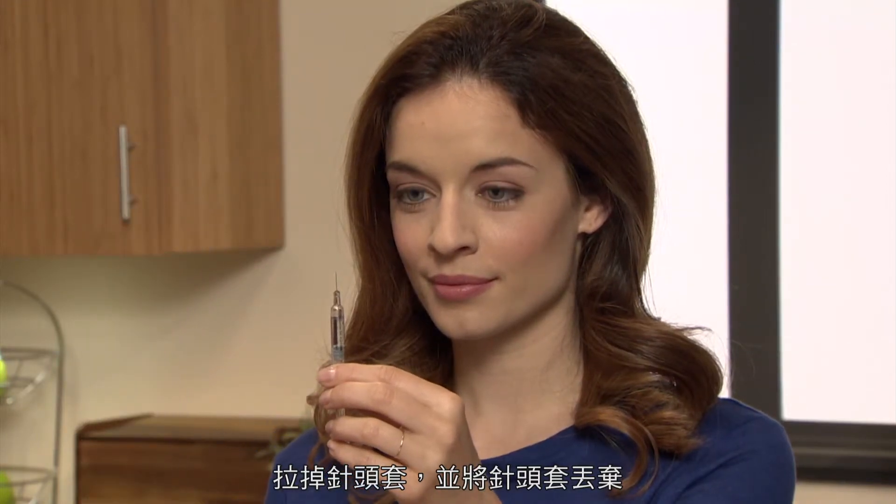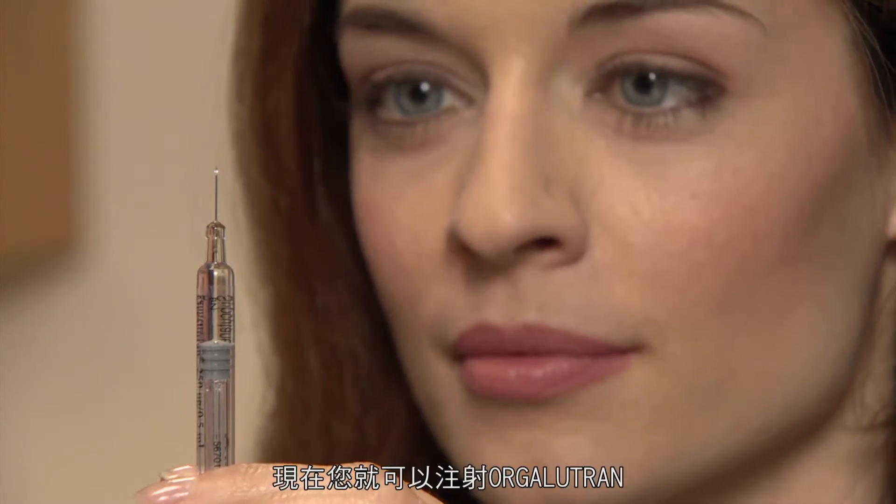Remove the needle cover by pulling it up. You may now discard the needle cover. Please remember to be careful with the needle at all times. You are now ready to give yourself an injection of Orgalutran.